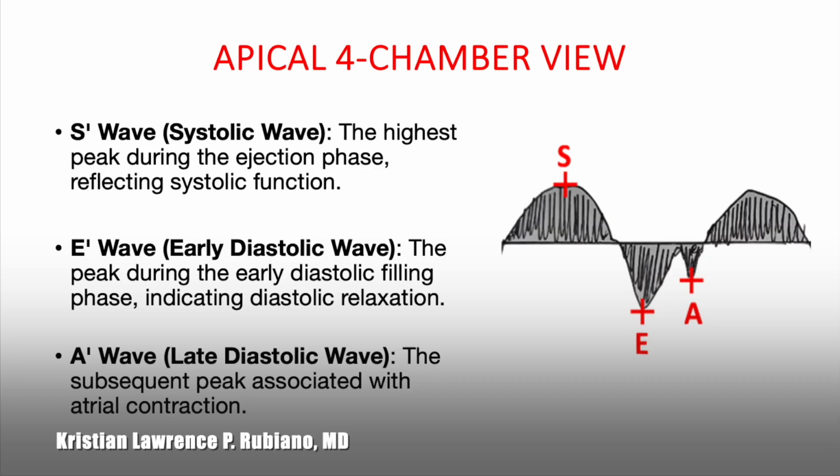The S wave or systolic wave is the highest peak during the ejection phase, reflecting systolic function. The E wave or the early diastolic wave is the peak during the early diastolic filling phase, indicating diastolic relaxation, while the A wave or the late diastolic wave is the subsequent peak associated with atrial contraction.